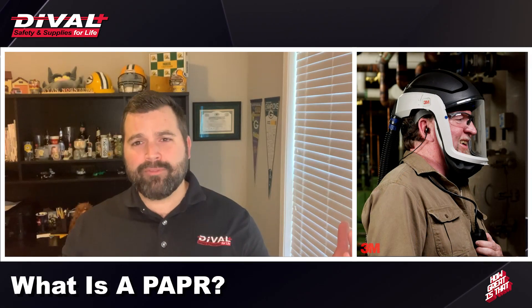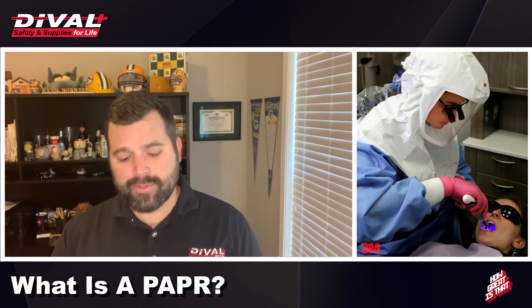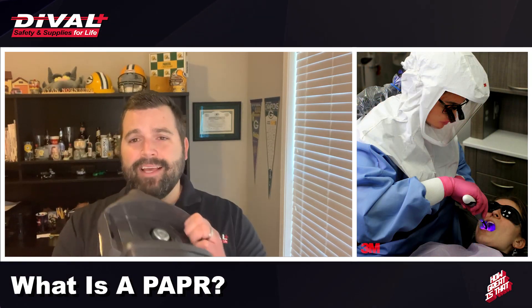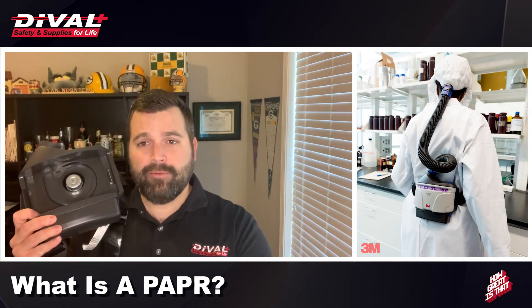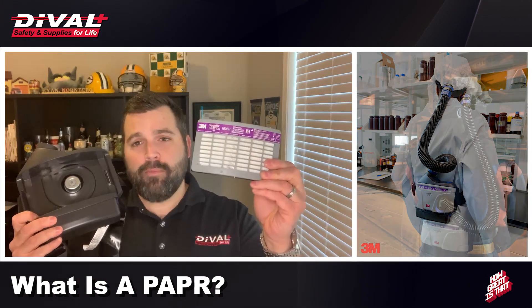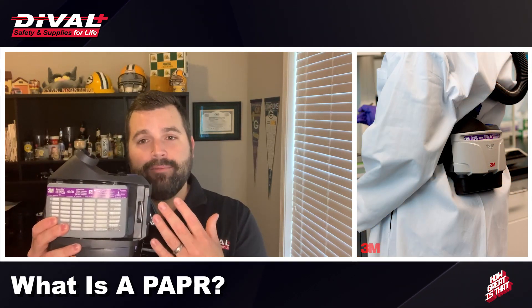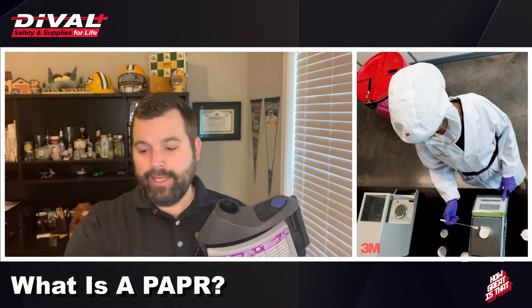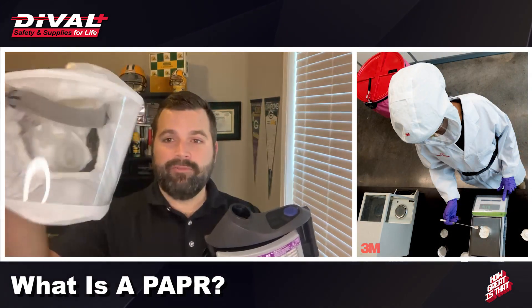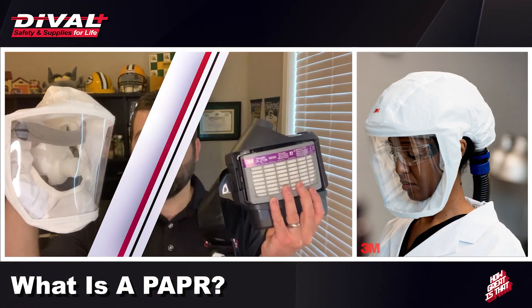So what is a PAPR device? A PAPR device is made up of four critical components. The first is an electronically operated fan, which pulls ambient air through the second critical component — a filter membrane. The filter membrane is installed into the fan components to pull ambient air through and purify it. From there, the fan sends the cleaned air through a tube and into some kind of head covering.